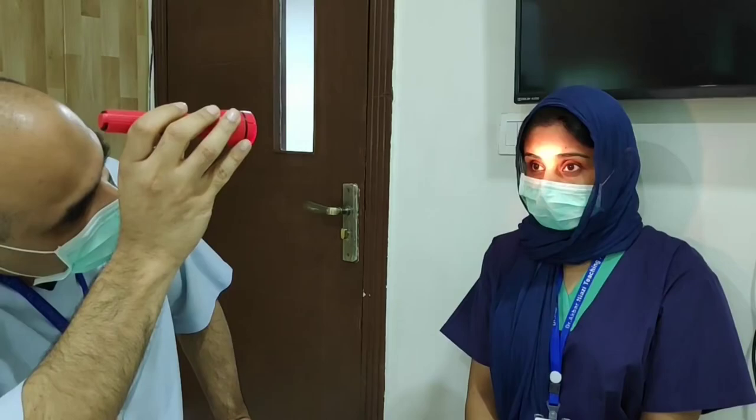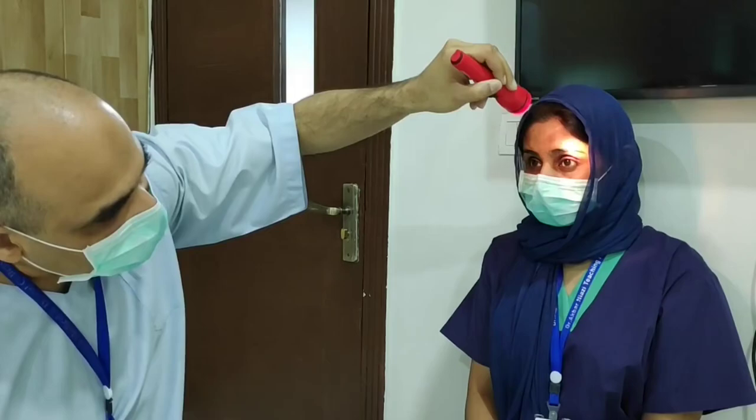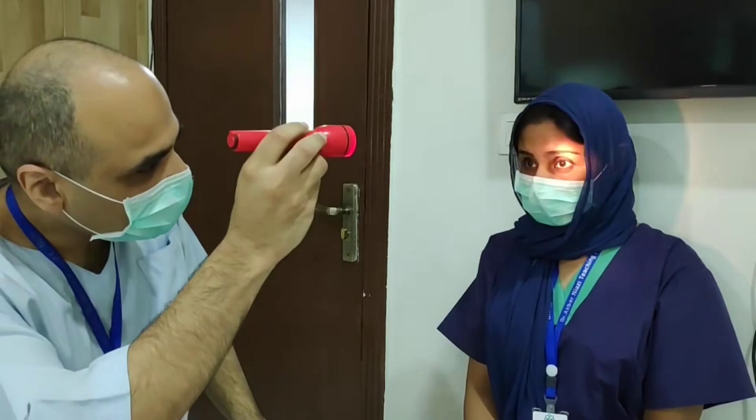In the demonstration, the first thing is to check the adnexa. Starting with the brows, shine the light at the bridge of the nose ensuring it is well-centered, and check the symmetry of the brows — are they at the same level? Then sweep the light over each individual brow looking for scars, swellings, or loss of hair. Scars indicate surgery or trauma; swellings indicate inflammation or tumors; hair loss may suggest endocrinological conditions. Then check the symmetry of the lids by shining the light at the bridge of the nose and noting the position of the upper lid.